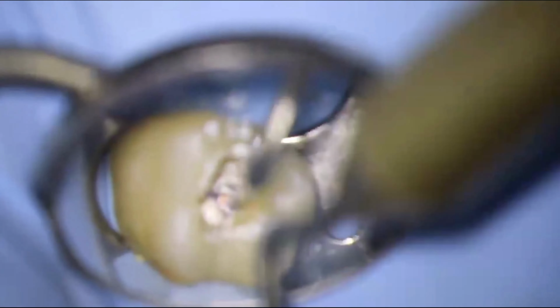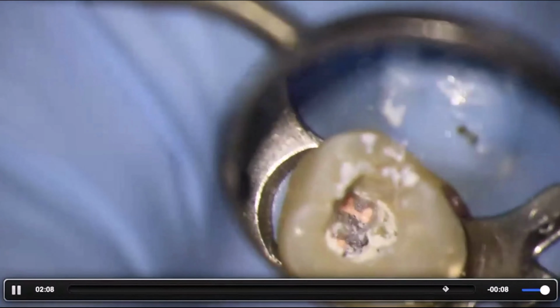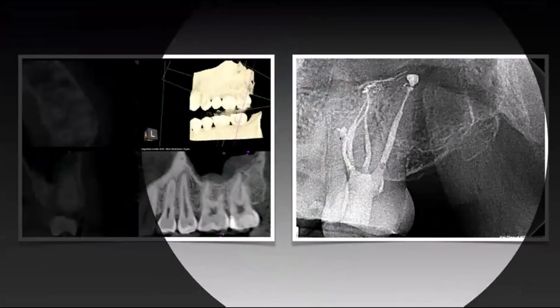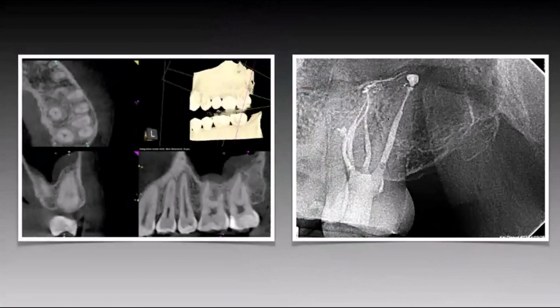And that's it. And then we're going to clean that all up. We'll fast forward this video. We'll clean it all up. Just make it neat. See there's sealer there. I like to use an ultrasonic just to get rid of some of the sealer, and we'll do other techniques to clean the access cavity afterwards, okay? So this is kind of what it looks like after. You can see the hydraulics and the sealer, how it fills some of those accessory canals and anatomy, etc. Okay?